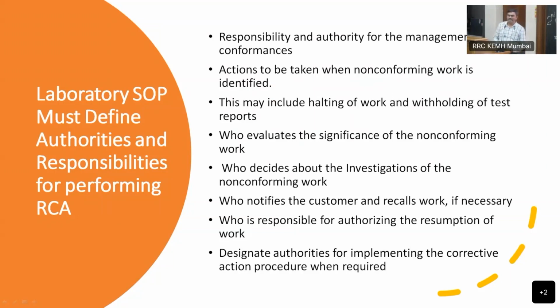So probably most of the time क्या होता है मुझे पता है 90 to 95% times क्या होता है कि वो reconstituted नहीं होता है या उसका टेम्परेचर अटेंड नहीं होता. Okay. And it is loaded directly on the machine. Okay.